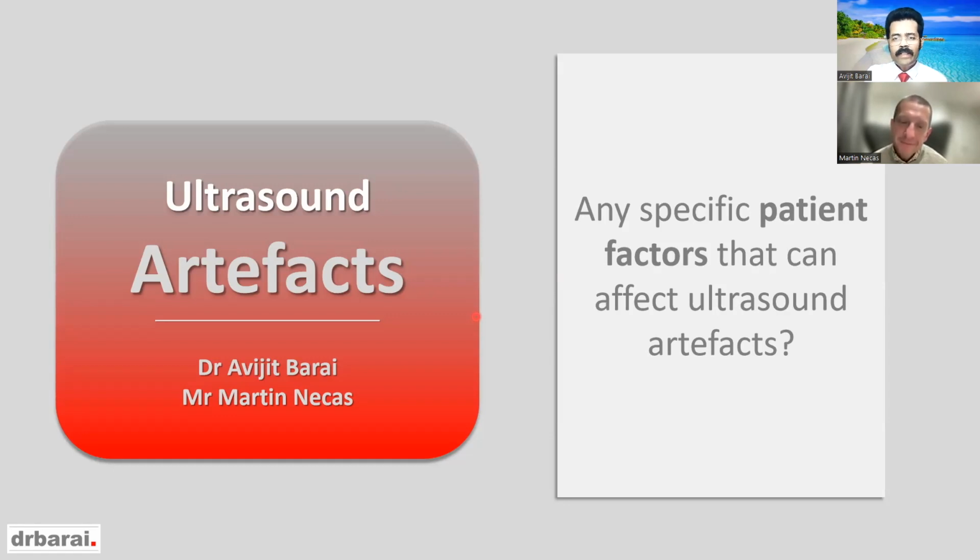And Martin, is there any patient factor that can affect the artifacts? You mentioned the pediatric patients and obese patients. Anything else? Yes, of course, it's interesting because every person's different. And so you'll find vast differences in attenuation, in reverberation. And sometimes it's very difficult to predict. On occasion, you may have a patient who is quite big in body size and you think, I might struggle here.